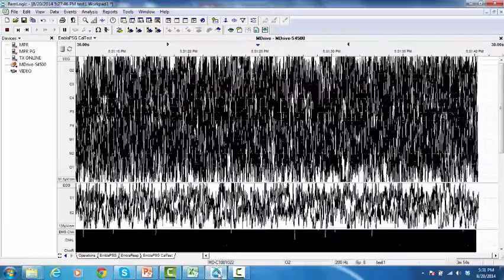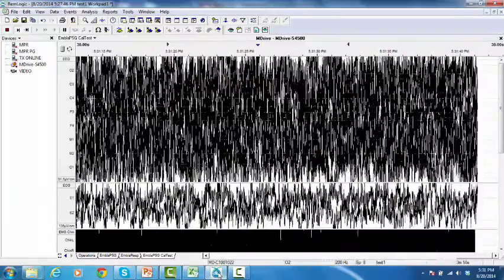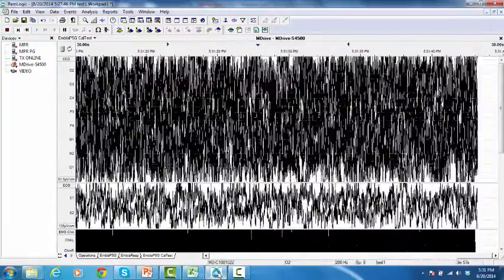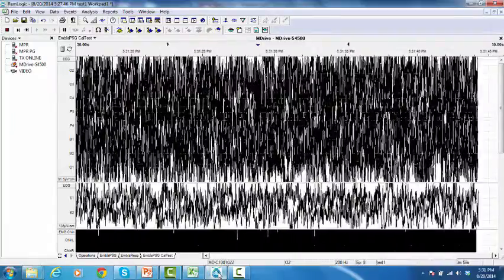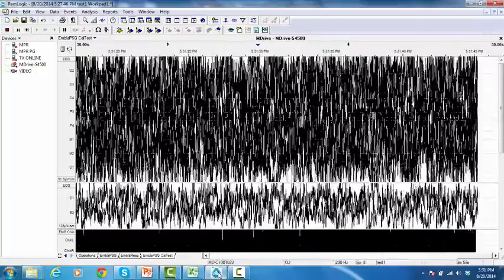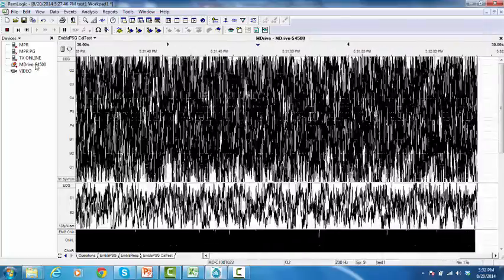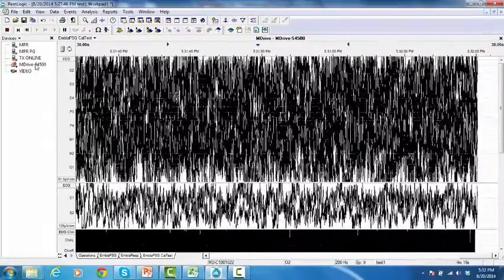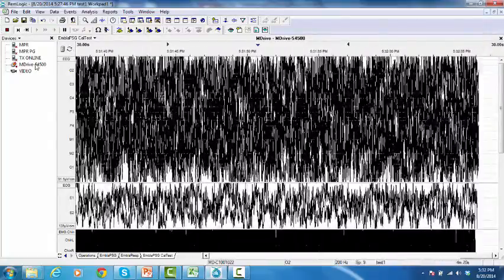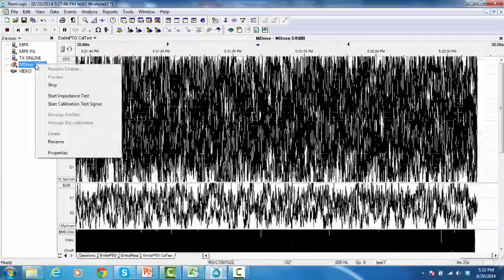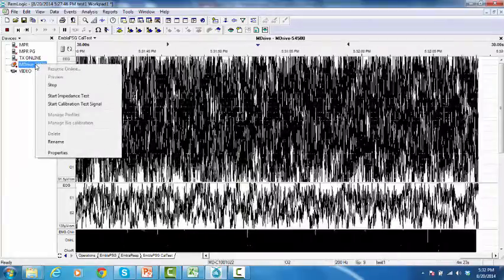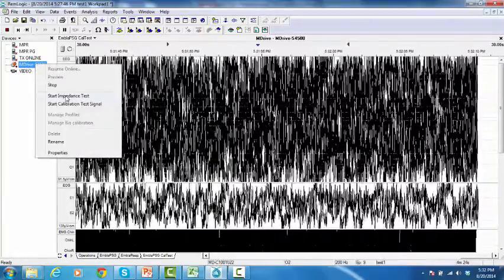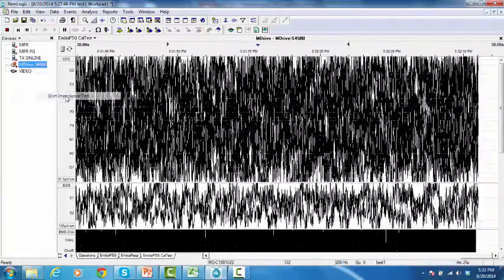To manually start an impedance test during a study, do one of the following. From the device manager, right-click on the M-Drive and select Start Impedance Test.